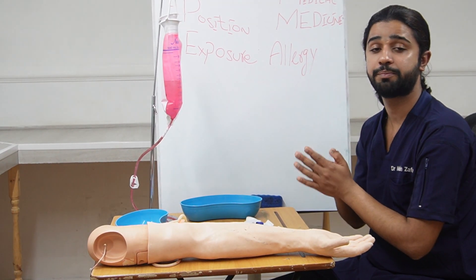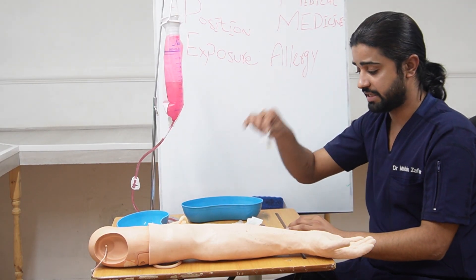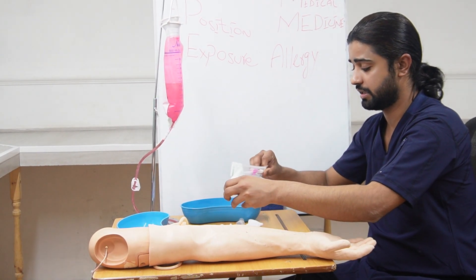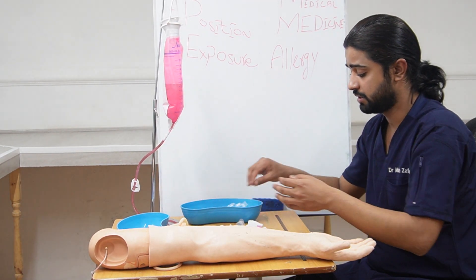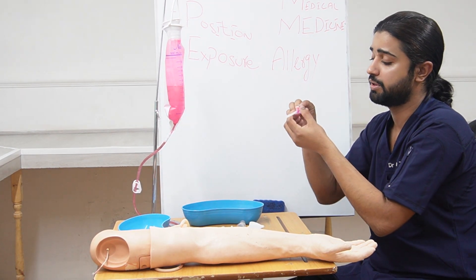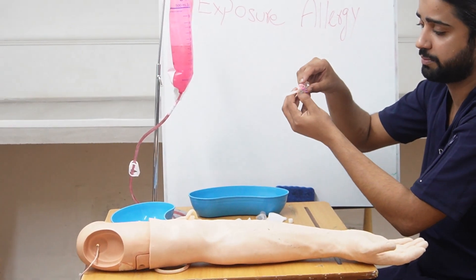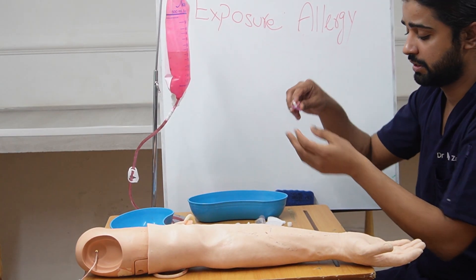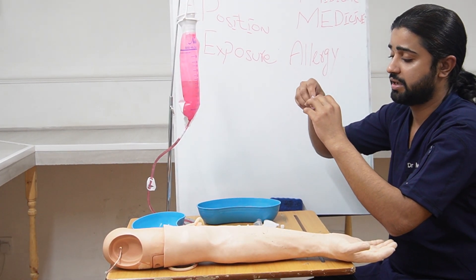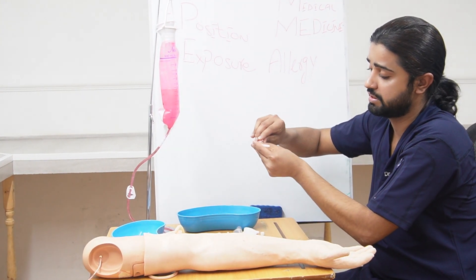Now I am going to start. Before starting, I would like to prepare my equipment. First, I will tear the outer packing and hold the swab without taking it out. Next, I will open the cannula and place it here. I will straighten the wings of the cannula. Then I will remove the stopper and place it aside, and loosen the cap a bit. So in this preparation part: I have removed the stopper, straightened the wings, made it easy to use, loosened the cap, and also opened the pre-filled syringe for flushing.